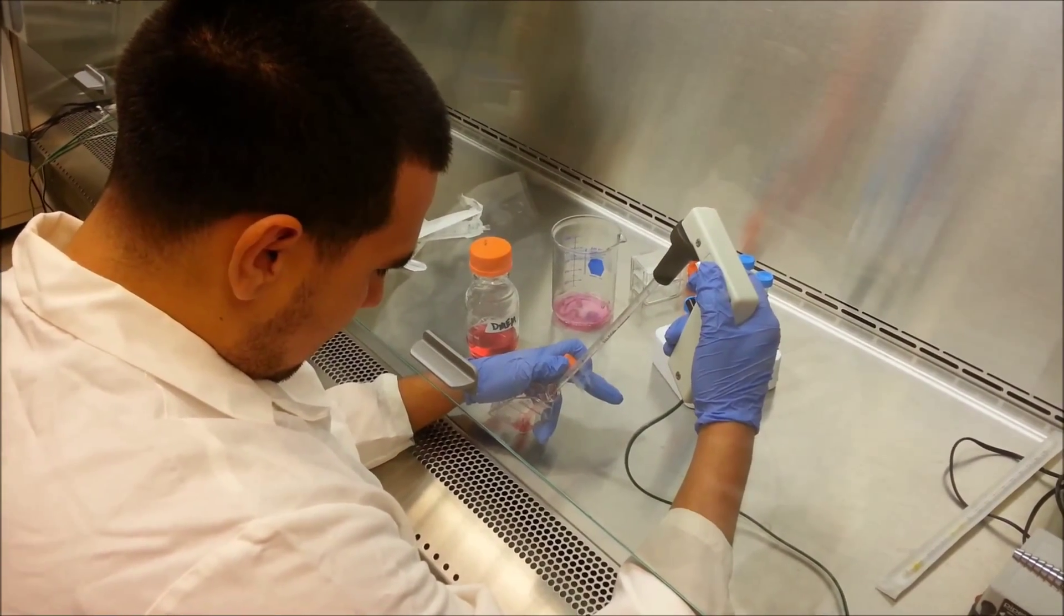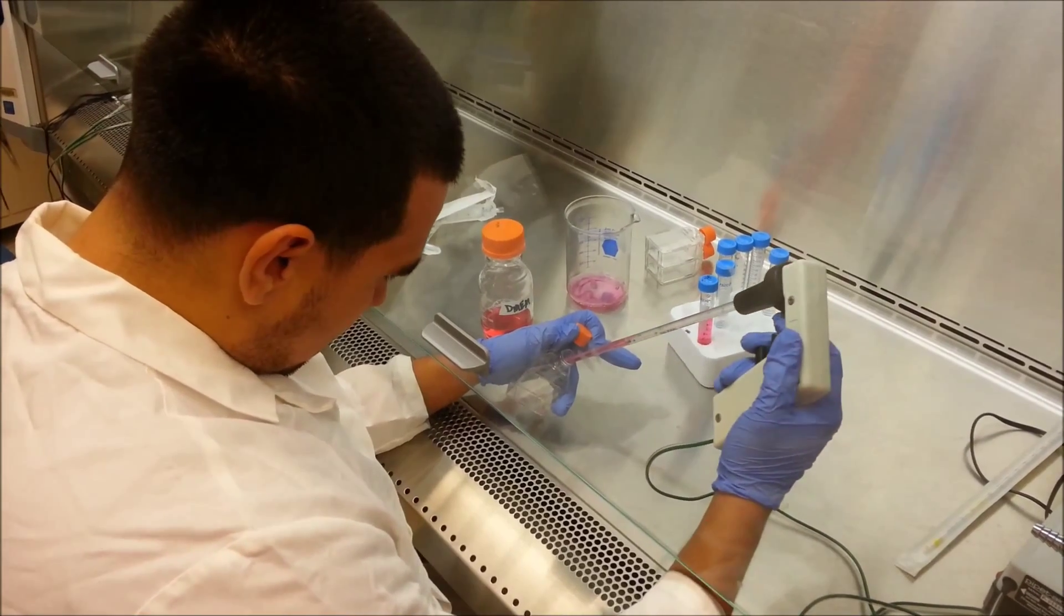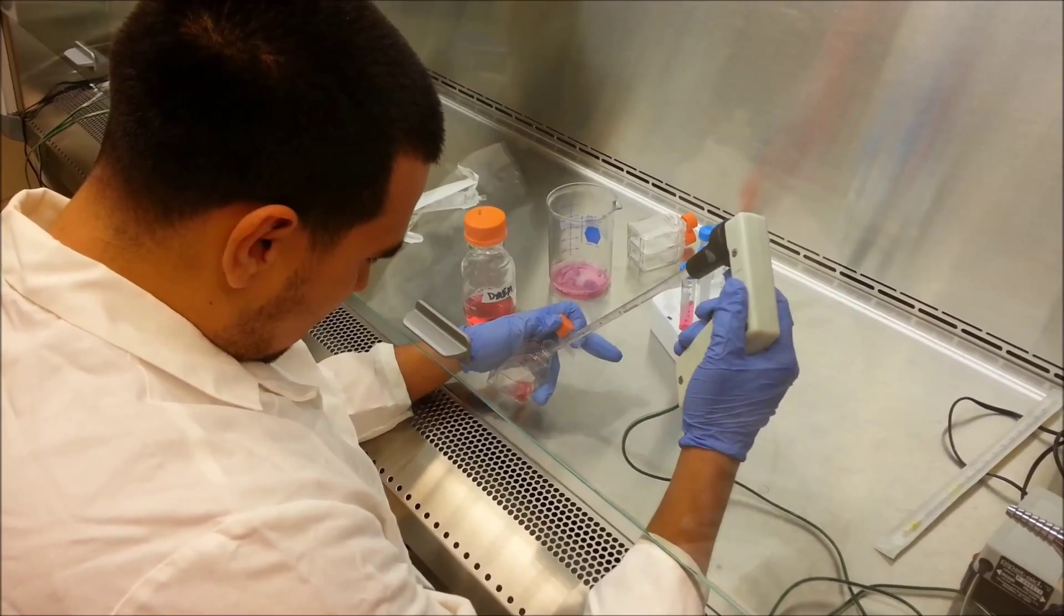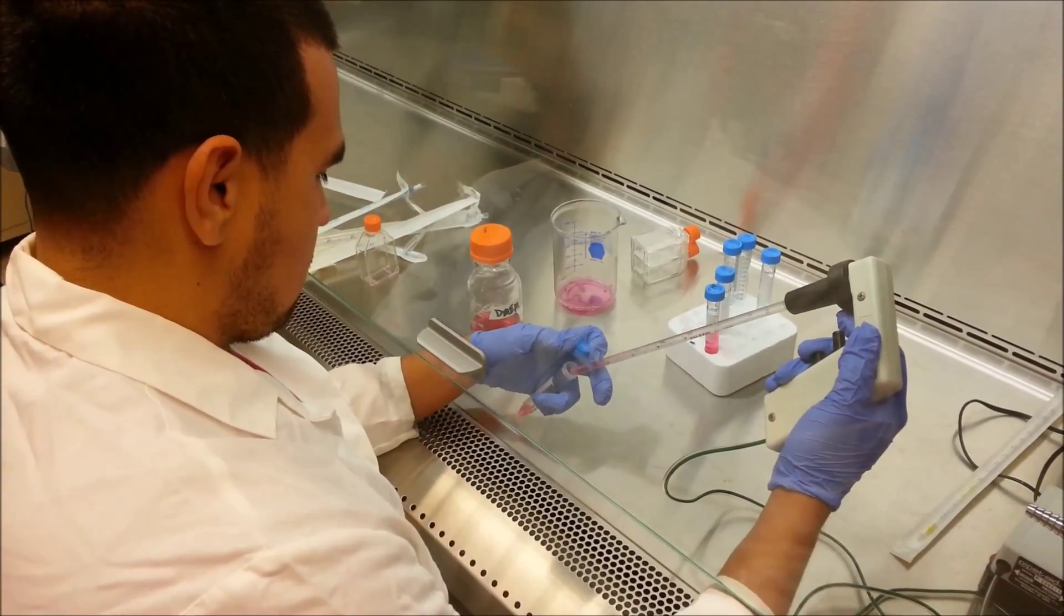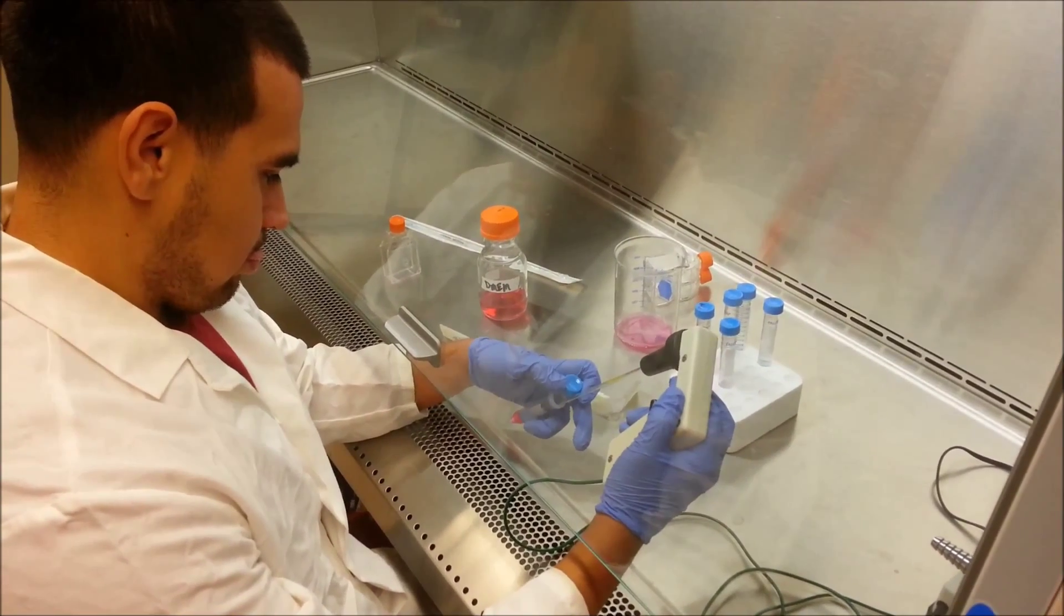Take about 3 to 3.5 mL of fresh media. Wash the cells down from the surface they were adhered to. Transfer them to a 15 mL conical tube and take a portion for cell counting.